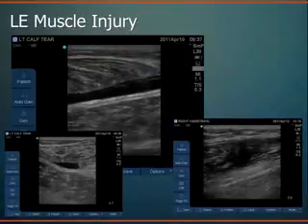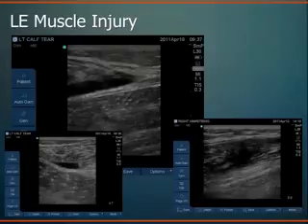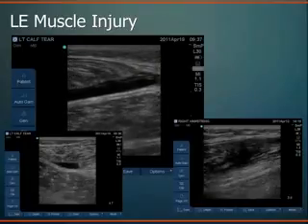Yeah, and what's nice is, when you're doing this, you're aspirating, and not all of them are straightforward. Is this infection? Is this gout? Is this just arthritis? Is this an acute hematoma? A lot of different things can cause a joint effusion. So if you need to aspirate that fluid, it's very easily identified, okay, that's where the suprapatellar pouch is. There's the swelling. Stick the needle right there, and you're right on it. And so it's very easily visualized and very applicable to a clinical setting.